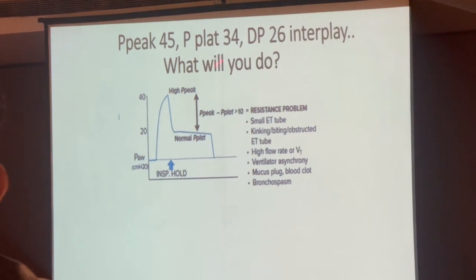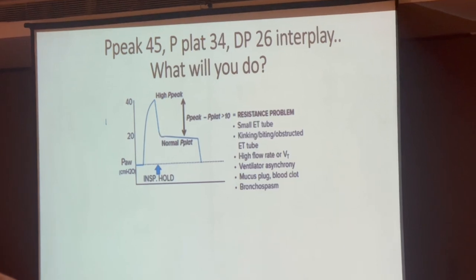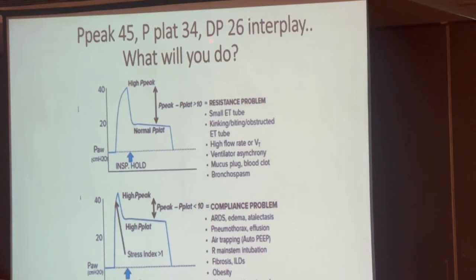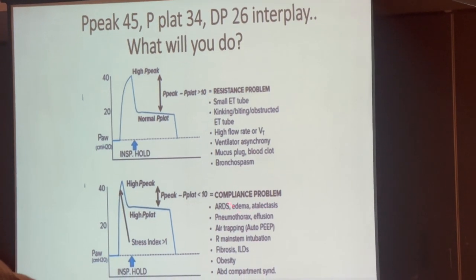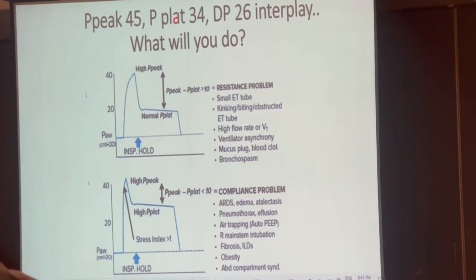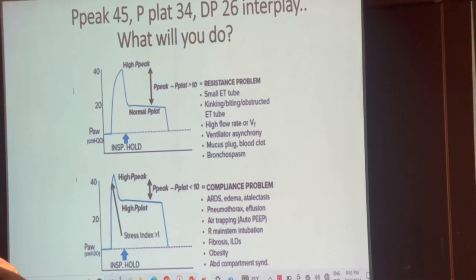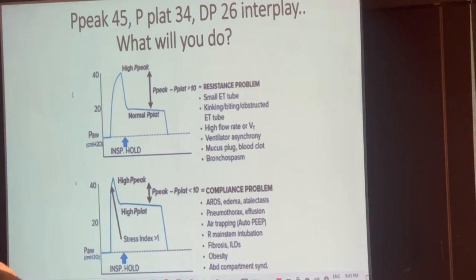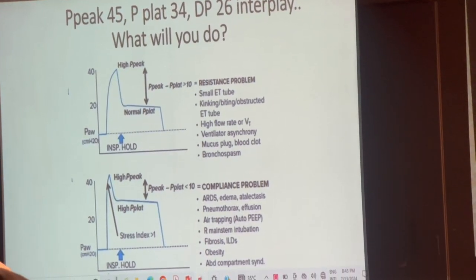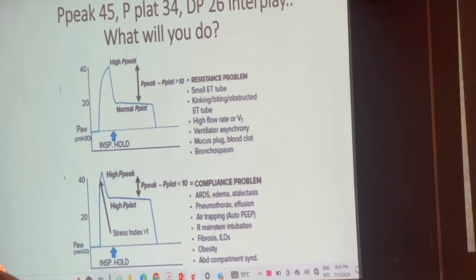Yes. So you have to look at all those problems of resistance, especially when the peak airway pressures are high, right? Because the patient has a rise in both the peak as well as the plateau, so you should also look at the compliance issues. Obviously, the patient has ARDS, but because the peak airway pressure is out of proportion to the plateau, you must think about issues related to airway resistance. Just imagine, we are talking about compliance issues, and the things get complicated by the airway resistance issue. This is how things happen when your patient is in the ICU, right?